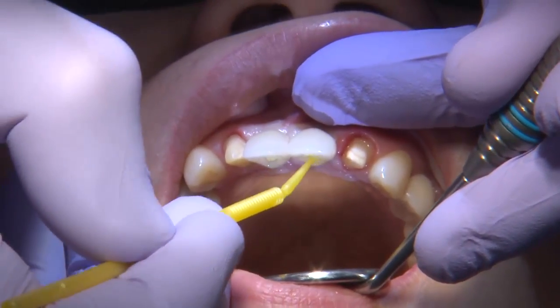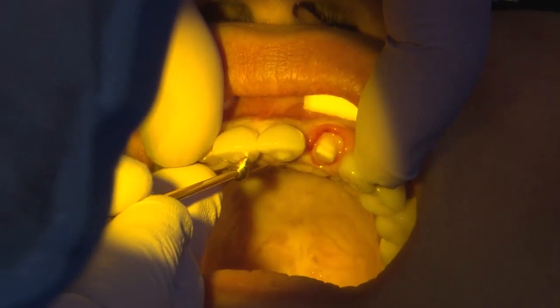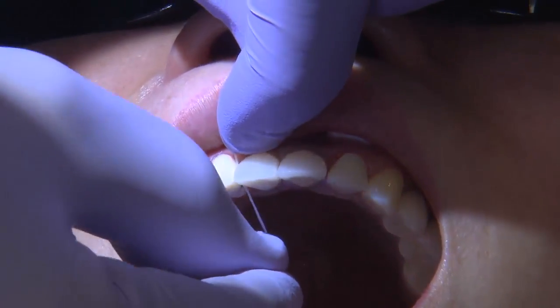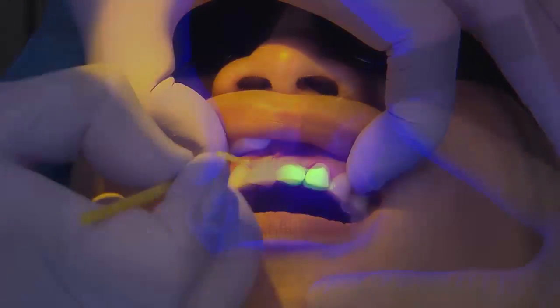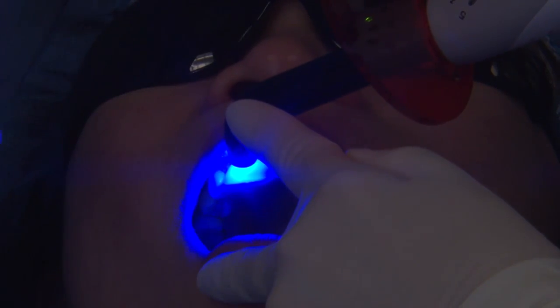I'll place Teflon and composite in the lingual screw channels of the implant restorations, and once that is set, I'll remove each lateral individually, adjust the contact point, seat them, and temporarily cement them — taking care to remove all excess cement, especially in the areas where the implants have been placed. An additional step to make the temporary more secure is bonding the temporaries together using bonding material and flowable composite, bonding the laterals to the centrals, giving me peace of mind that the patient won't dislodge the temporaries during the healing period.